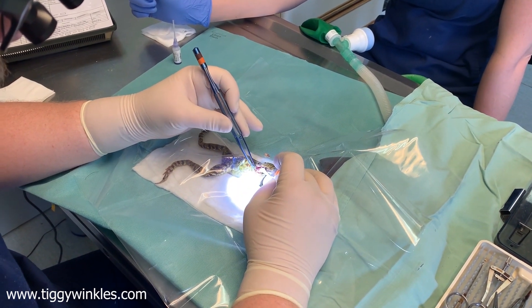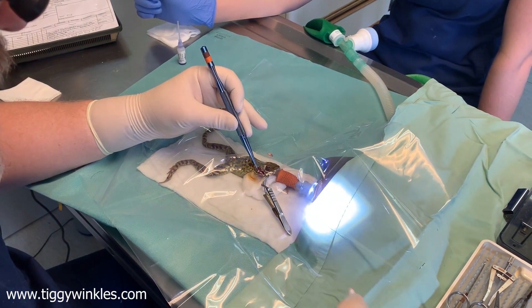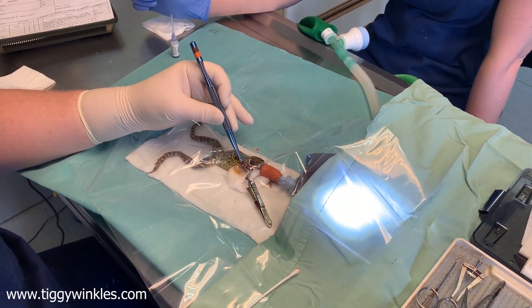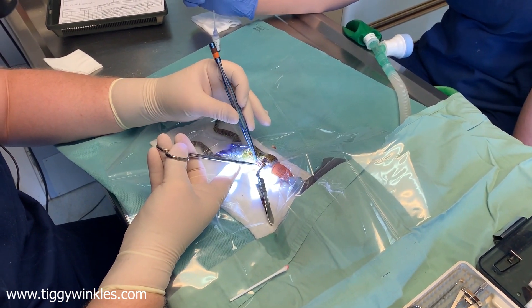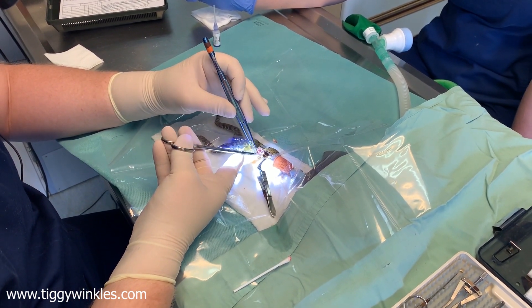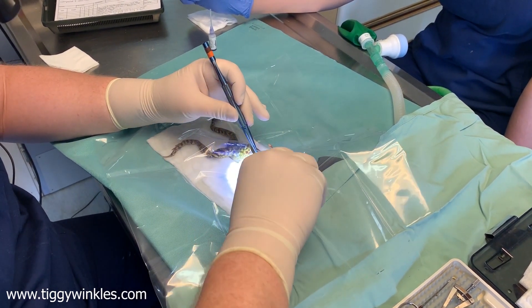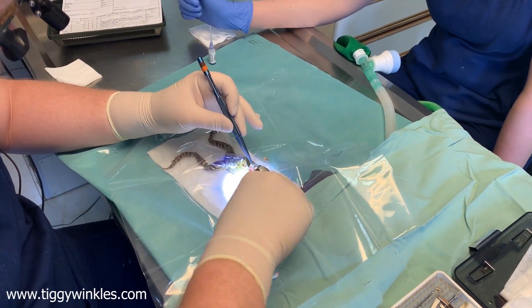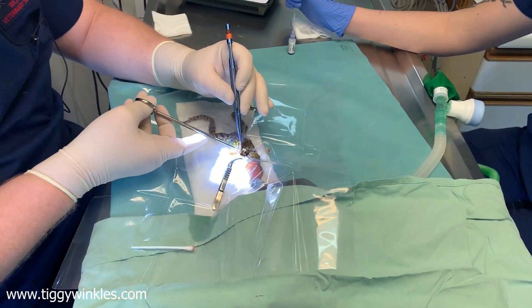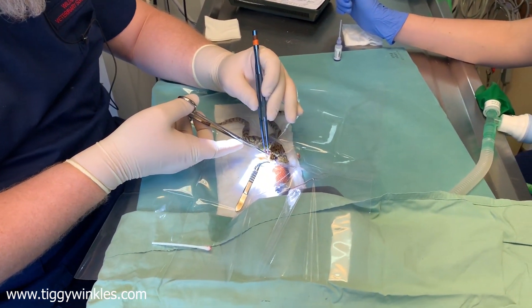The most straightforward approach is to free this tissue up just a little bit first. I'm wearing magnification so I can see things in a lot more detail than you can appreciate with the naked eye — it makes life a little bit easier and means I can do things with a bit more accuracy in these very small tissues.